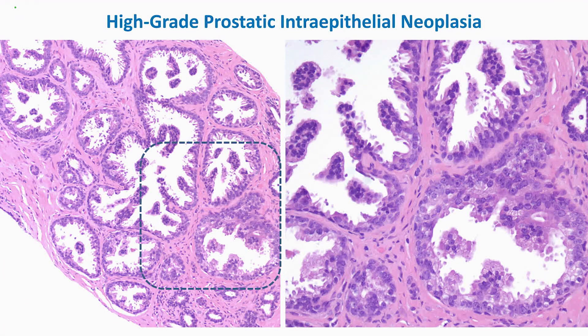Here is another example of high-grade prostatic intraepithelial neoplasia. You can see some degree of complexity of the overall architecture and papillary projections; nuclei may be easily identifiable. There are enlarged nuclei with prominent nucleoli, and at high power most of the cells lining these glandular spaces have enlarged nuclei and prominent nucleoli.